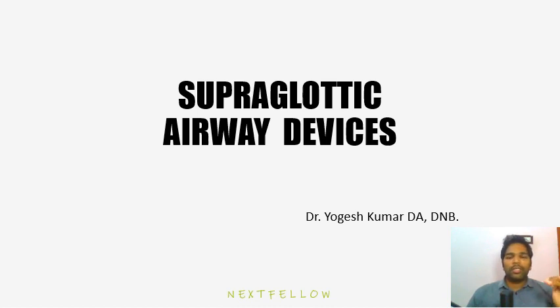You might wonder why they are named supraglottic airways. I will give you a simple example. We all know from the airway anatomy classes that the entrance to the larynx is called the glottis. When we put a device above the glottis, it is called a supraglottic airway device. Supraglottic airway devices consist of face mask, oral and nasopharyngeal airway, and LMA. But in common clinical practice, we refer to them as LMA.